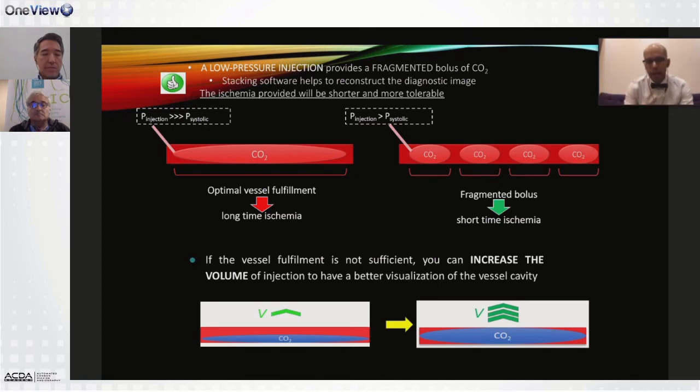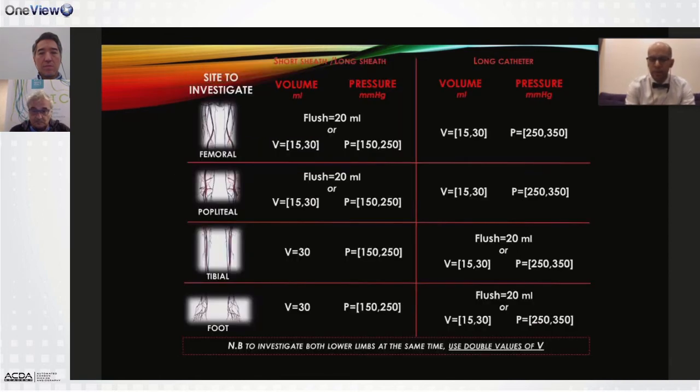So again, I can't give you magic numbers. We do a specific volume protocol for all our patients, trying to make things consistent, but it's a balance between basically pressure and volume, and with time, everything will be very clear.